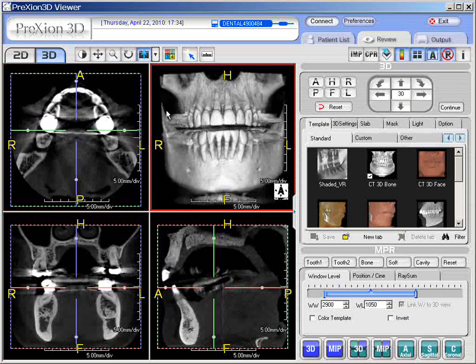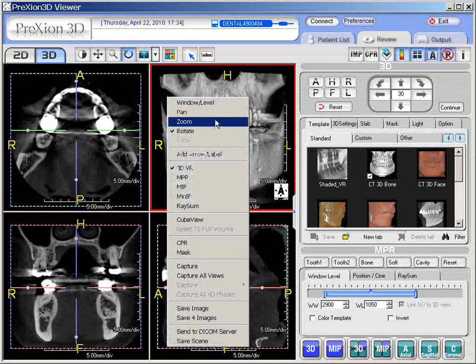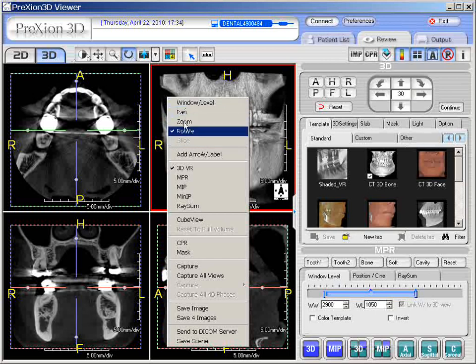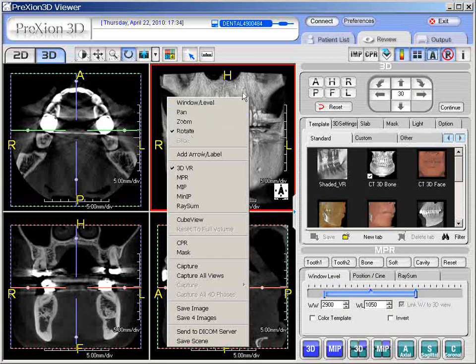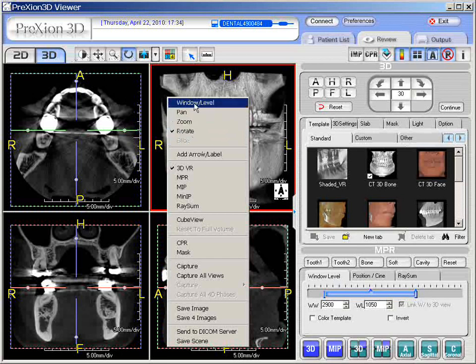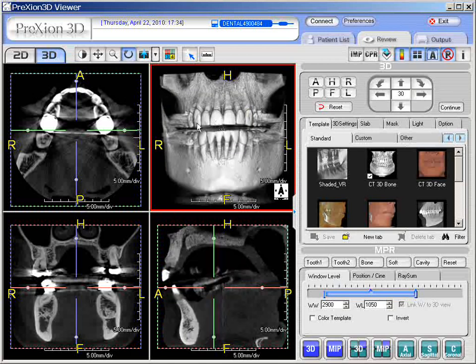One other item regarding adjusting the mouse and window level: you can right click to pop up a menu. These items in the menu correspond to the same icons described earlier. So if one wants to choose a function with the right click of the mouse pop-up menu, it leads to the same icons. It's all one's preference — these options will dedicate the left click of the mouse to these functions, the same as the toolbar icons. Or you can use the mouse independently for all the functions just covered.